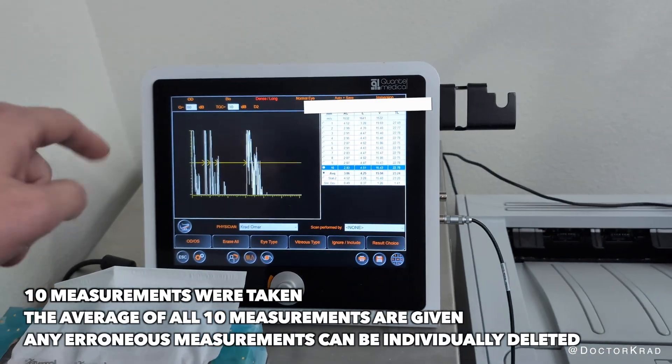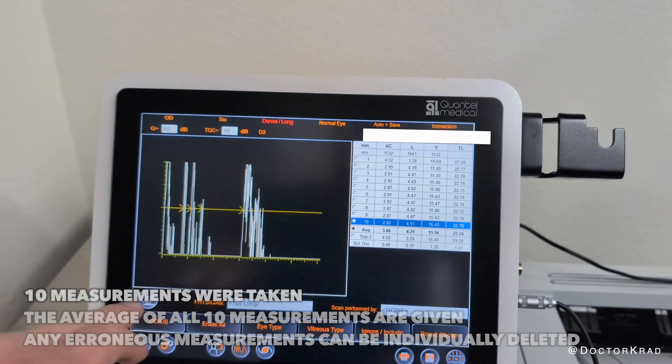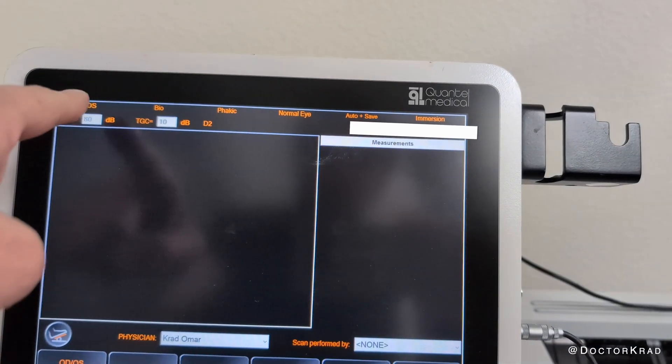So it just recorded 10 measurements from the front of the eye to the back. Now we're going to switch eyes.